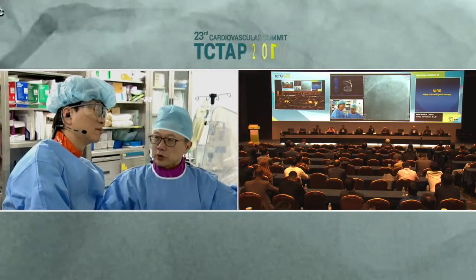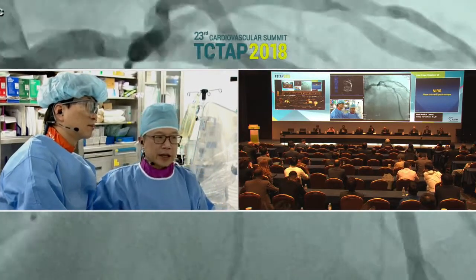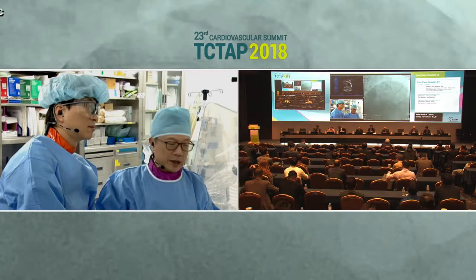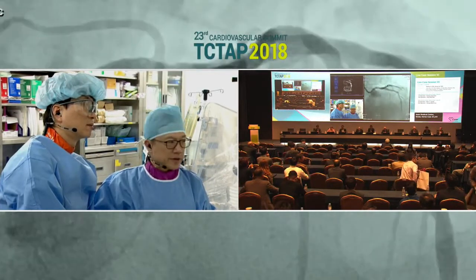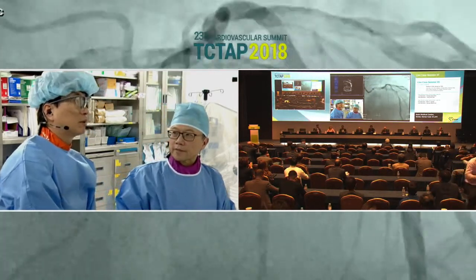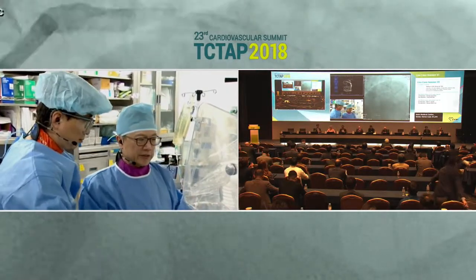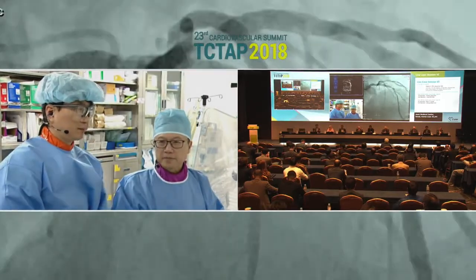We fixed that first OM. So basically now his right is fixed. It was a proximal large right. And I think his ventricle may improve. We were just at a time when he was having an MI. The circumflex is taken care of, and the left main LAD is taken care of. So let's see clinically how he does and go from there. I hope the outcome is very nice. All right, thank you very much, Steve and Dr. Tak and the panel.